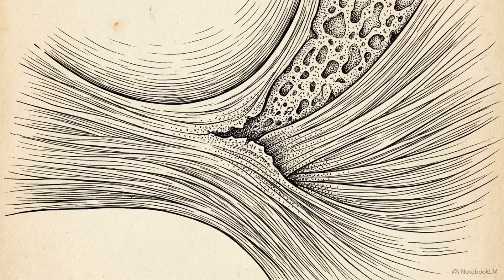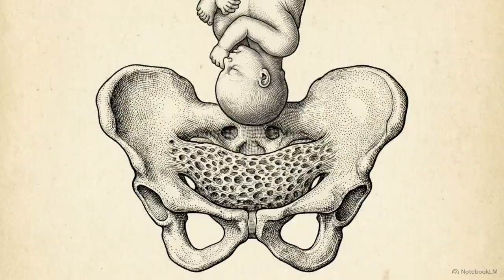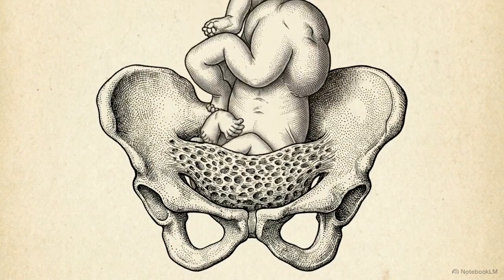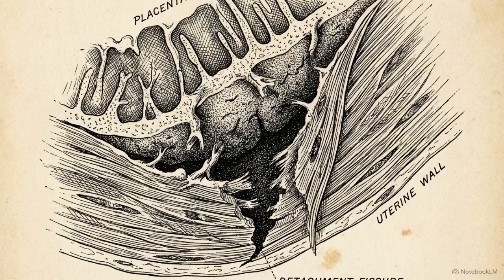Because the lower uterine segment thins out as pregnancy progresses, these low-lying attachments eventually tear. This creates the classic clinical presentation of placenta previa, painless vaginal bleeding in the 3rd trimester. This precise mapping of the placental edge provides a definitive answer to one logistical question: whether a safe vaginal delivery is physically possible. A properly placed placenta can still fail if its attachment is compromised.